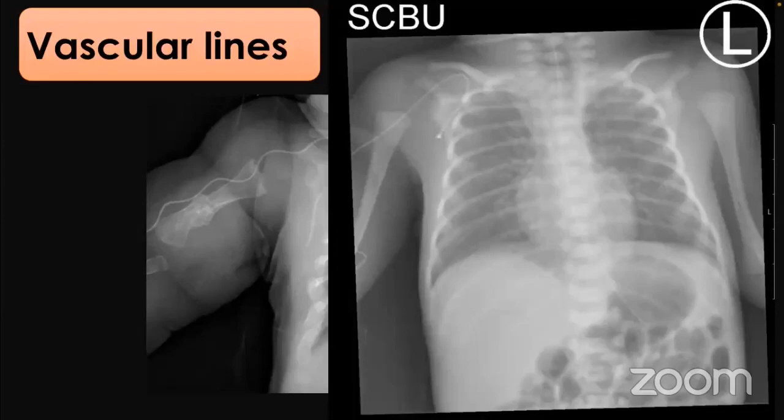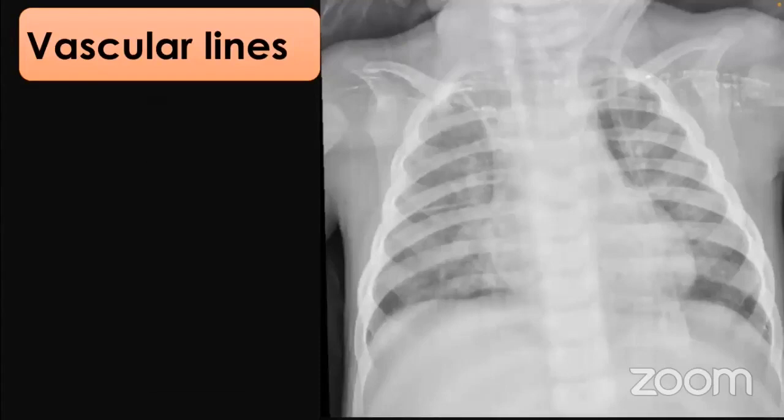And here another malpositioned vascular line. And here another vascular line, which is malpositioned.